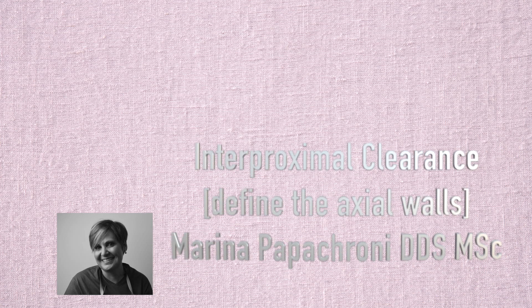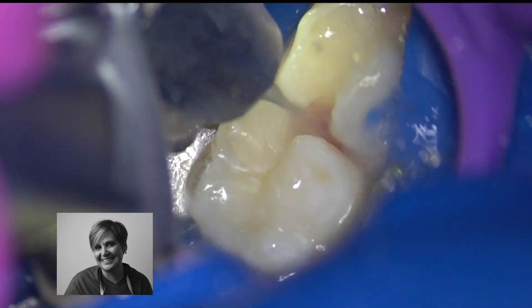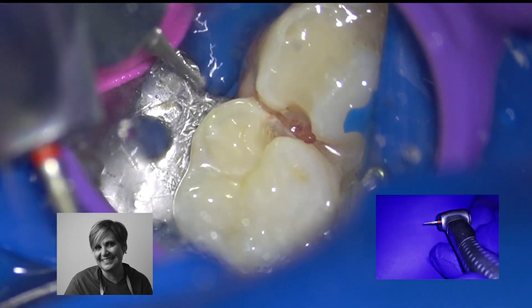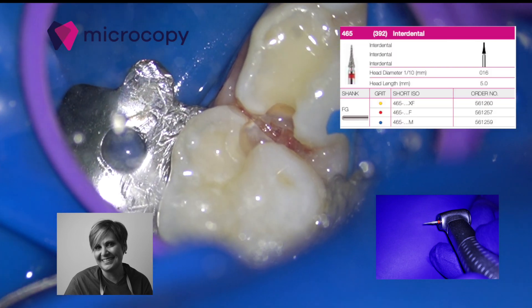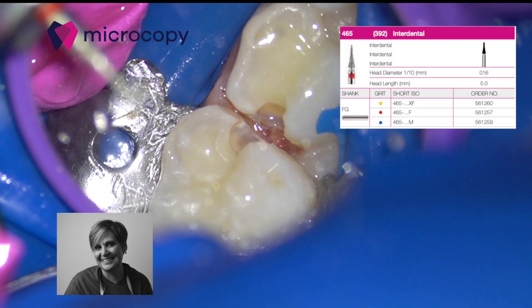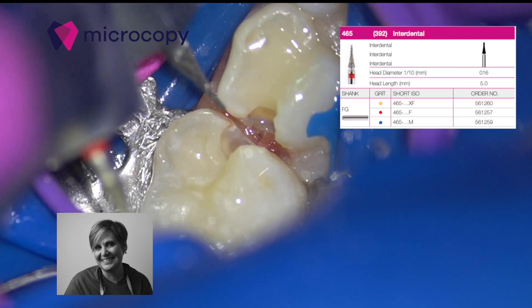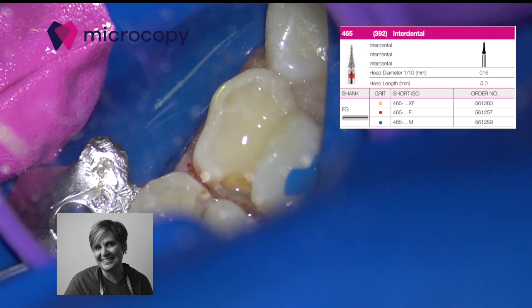Let's see a simple way to define axial walls in class 2. Using an interdental diamond, we make accessible palatal and buccal margins, which allow better cleaning, especially in high-risk patients.